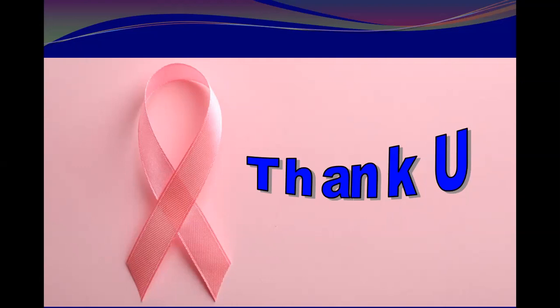You will increase it. You will put the skin and nipple areola and this area in the narrower zone of the transducer, the narrower field or elevation zone focus. So this is the narrowest part, the sharpest image.